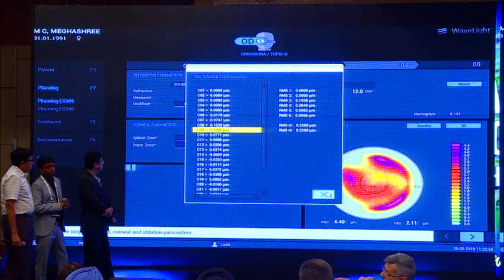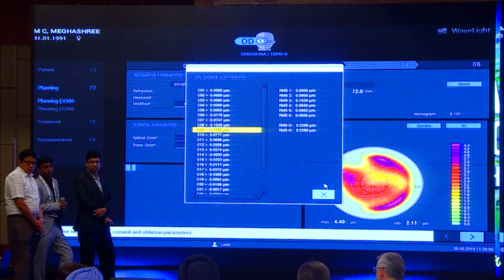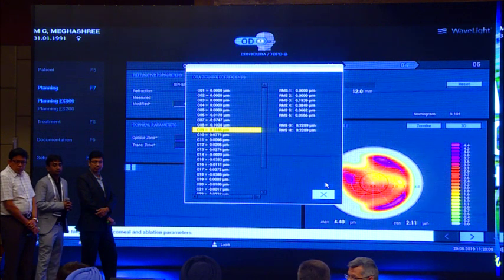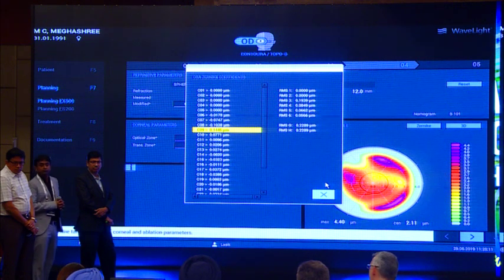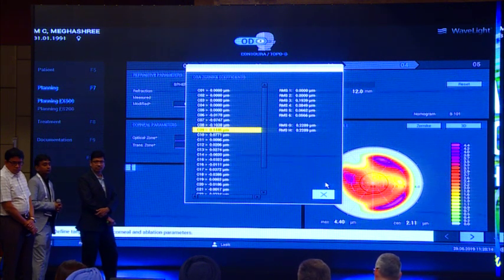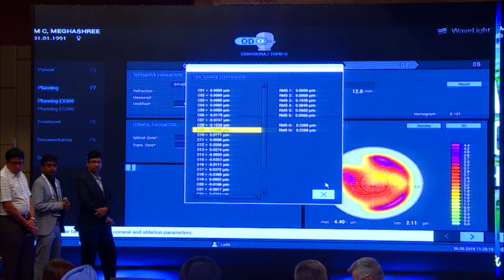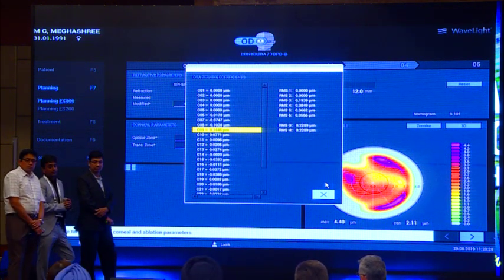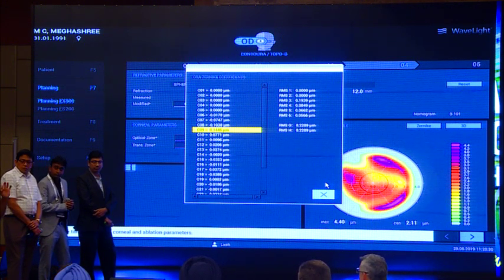Exactly. There was also a good point here from Dr. Gekle that he made. Maybe this helps. A subjective refraction is just a subjective impression of what the patient thinks is good. And when we give more different axes, maybe the patient feels to have a little bit more contrast, but it still remains something subjective. And me personally, I always trust completely the CONTOURA cylinder and axis, because I don't give anything on the subjective refraction. So you go only by the CONTOURA cylinder.